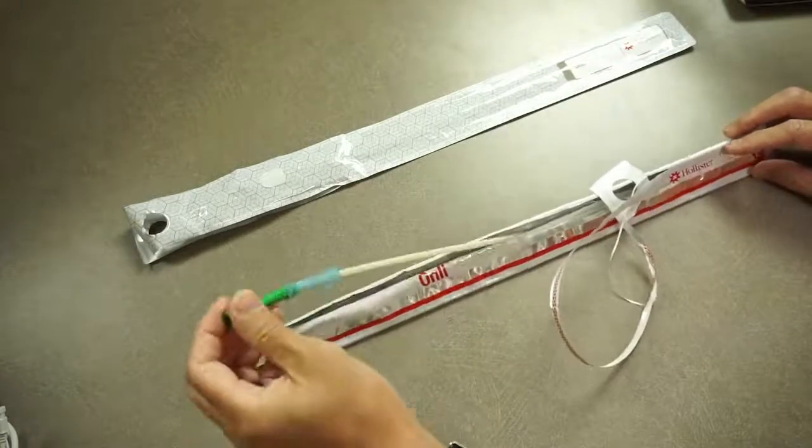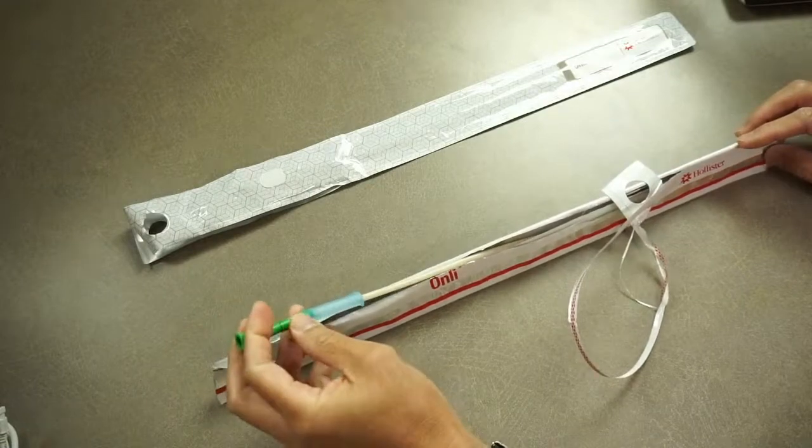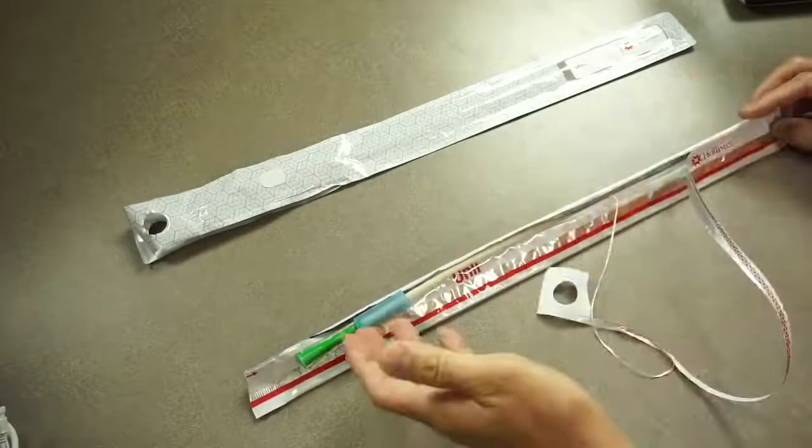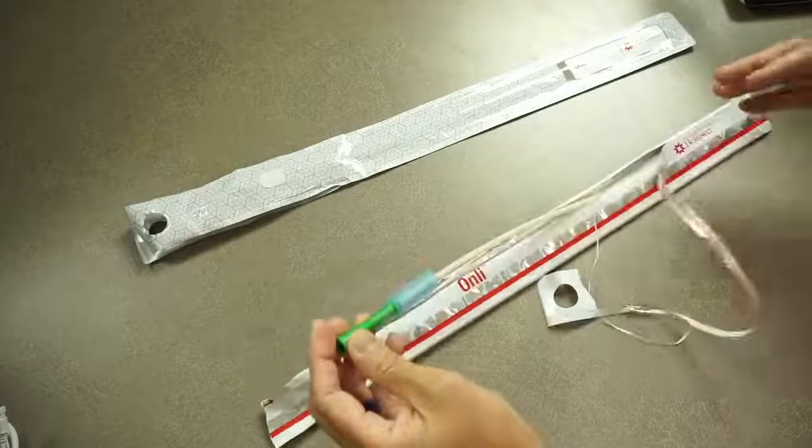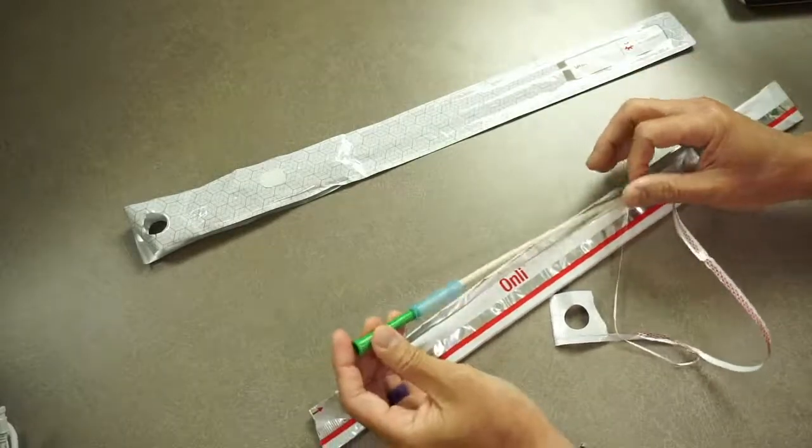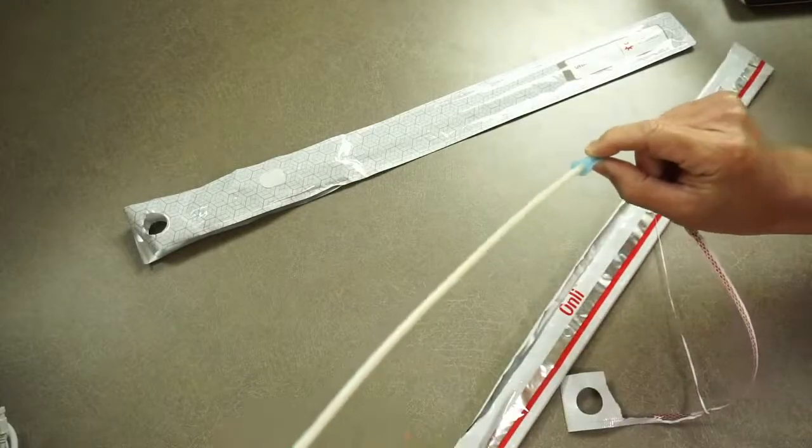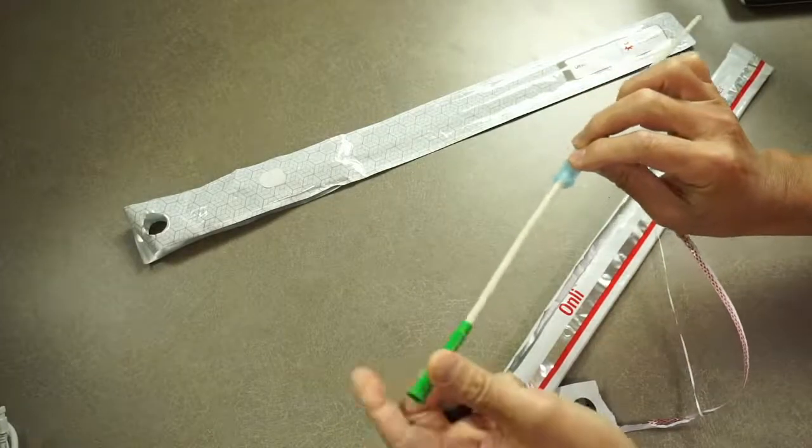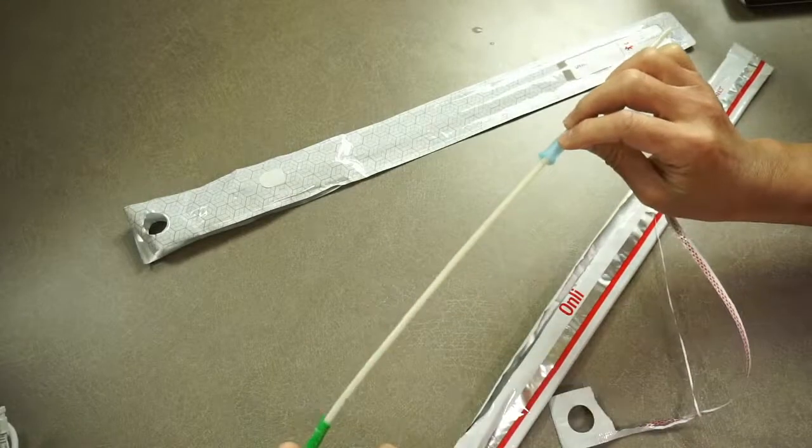For those interested, this is a pre-lubricated catheter, meaning it's pre-hydrated and ready to use. There's not a lot of fluid in here once you open it up, so you're not going to stain your clothes or surroundings. You don't have to find any water to get it very slick. There's a holder right here on the blue sleeve, so you can hold it without touching the catheter to maintain sterility.